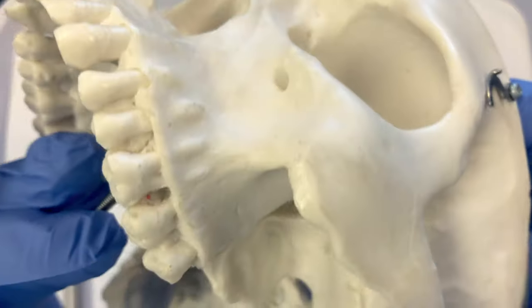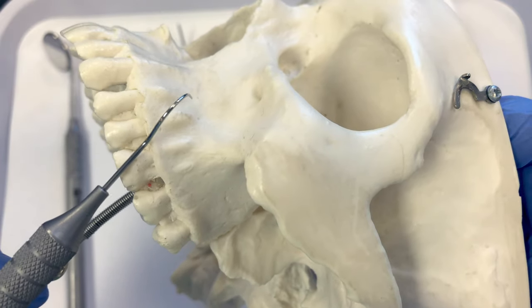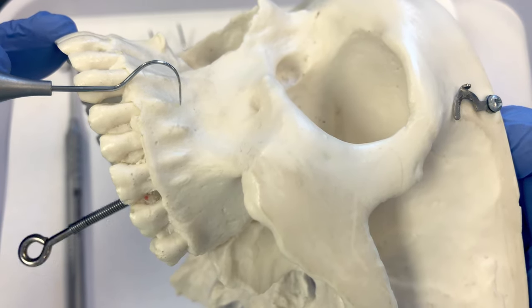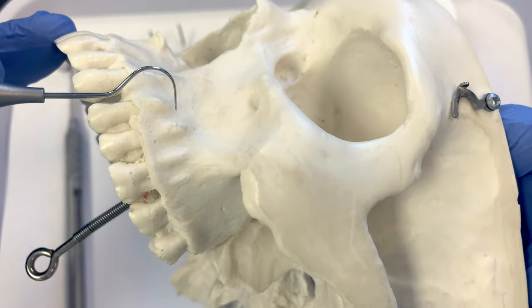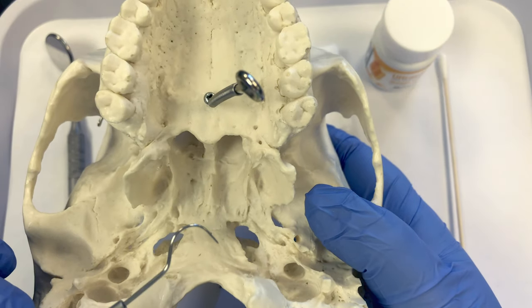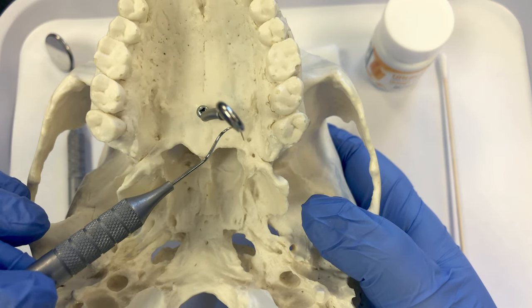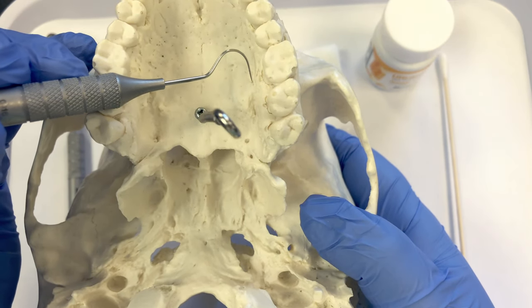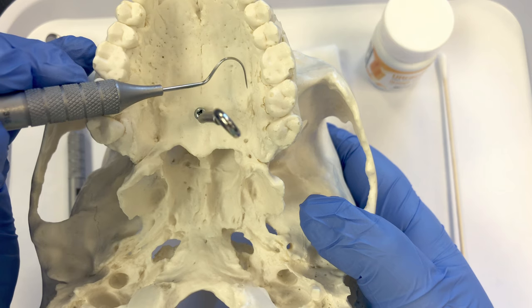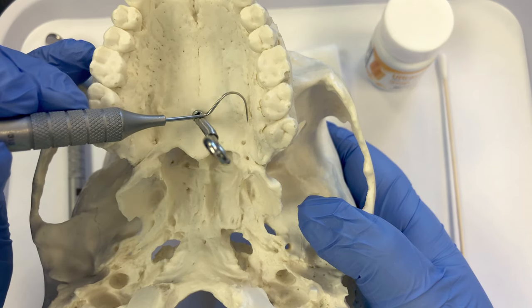If the doctor is doing an infiltration on tooth number 12, you would place topical apical to tooth number 12, right in that mucobuccal fold. Now if the doctor is injecting for a greater palatine nerve block, jaw opening limitations mean the doctor cannot inject directly near the greater palatine foramen. Instead, the doctor injects closer to the palatal side of the first molar, and the needle inserts at an angle and travels under the soft tissue.